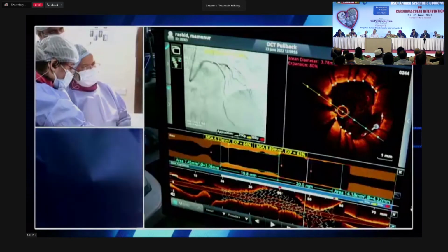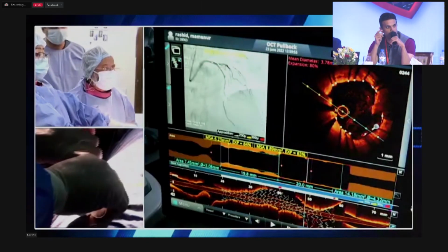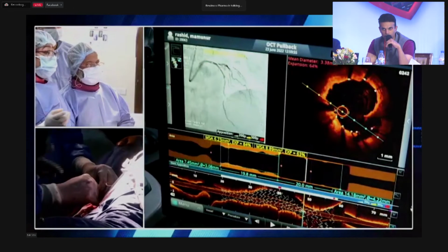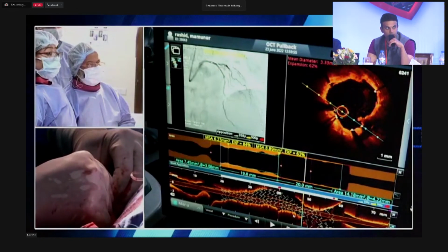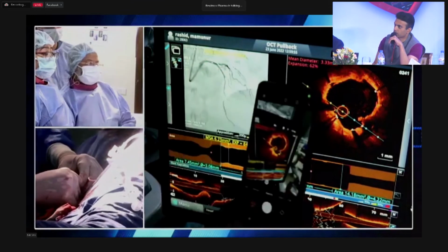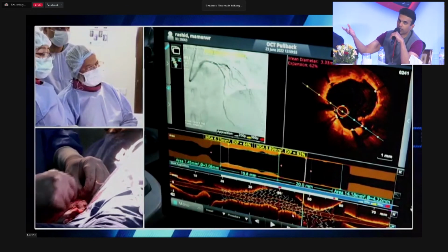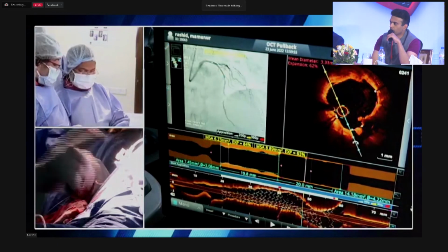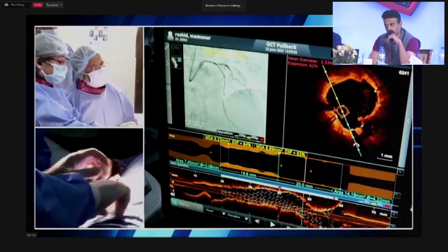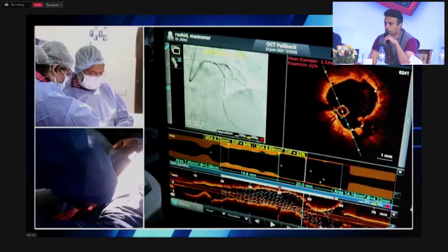So I think one high pressure patient with an appropriate balloon. Exactly. So that's just what I recommended. But the point of discussion here is that we pulled the circ wire out, right? And when you do bifurcations, in my opinion, there's no good reason to pull a wire out of the side branch till you're done, because it's not causing you any problems. And it's your wire access to your side branch, in this case, the circumflex. It may look just fine on an angiogram, but we've all learned that angiograms are not very good at telling us what's going on. Certainly, the angiogram didn't show this thing, right? So I'd put the wire back in the circ. I'd take a one-to-one sized NC balloon. I'd post-dilate it. And then you can either re-IVUS, re-OCT, or accept that you've done what you can, because your next step is going to have to be to take another stent. You probably don't want to do that.